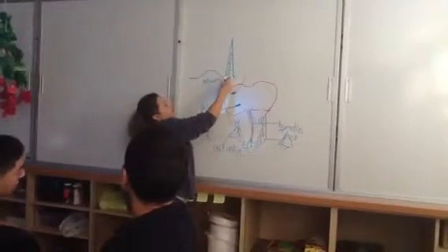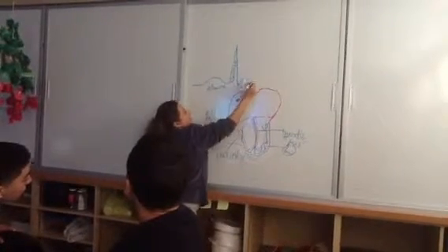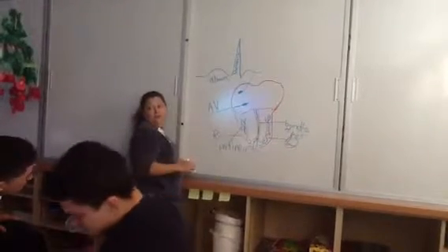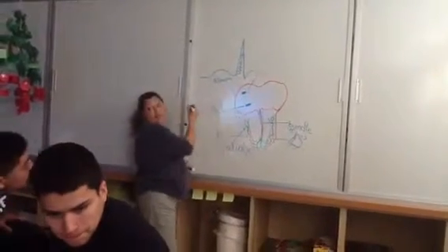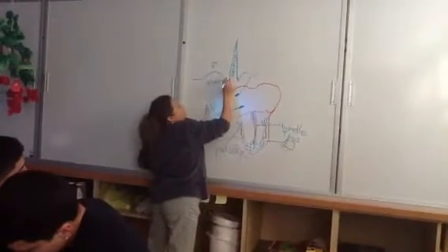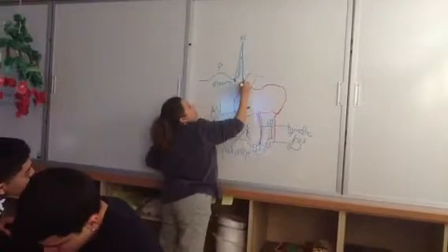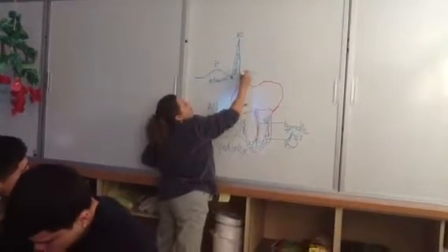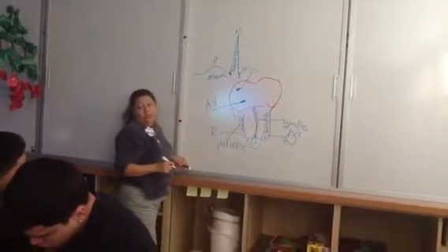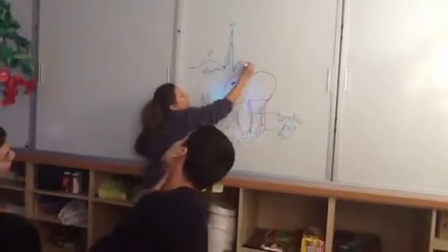So it's a slight drop below your isoelectric line, so it's like here, and then it'll go up, and it's just a small hump. It's not even that obvious. Okay, that's your T wave or your U wave. So your T wave is down here. So this is labeled P, and then this is Q. This little part right there is Q. This makes more sense. This is R, and then this is the S, this is the T, and then you'll have another little one, a U wave, but usually older people have it, so you may not see it in us. But you may have another little glitch like that.